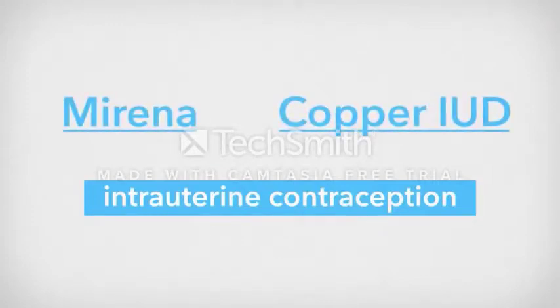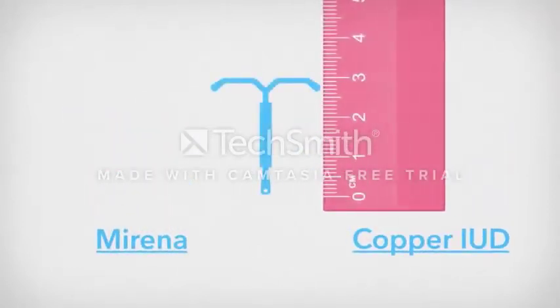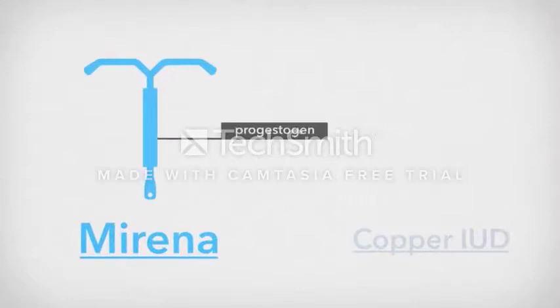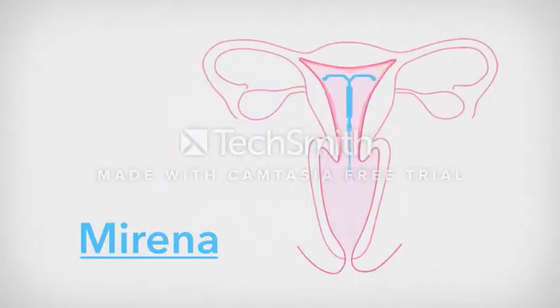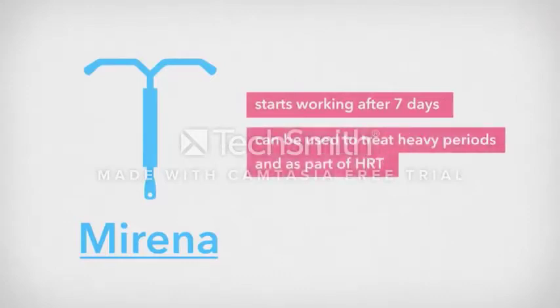The Mirena and the copper IUD are both small plastic T-shaped devices that sit inside the womb. 2 soft threads at the bottom sit high up inside the vagina. The Mirena has a hormone called progestogen within it. This hormone makes the lining of the womb thin and also makes the mucus at the neck of the womb thicker, so sperm can't get in. The Mirena takes 7 days to start working effectively. The Mirena can also be used to treat heavy periods and as part of hormone replacement therapy at the time of the menopause.